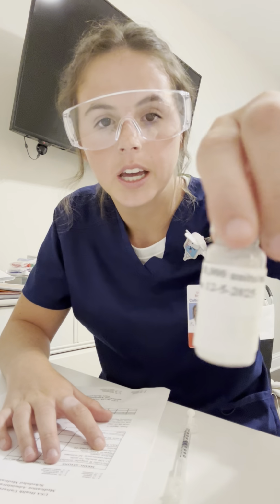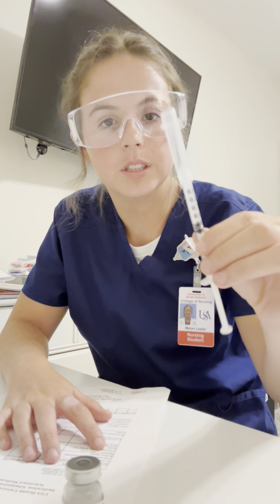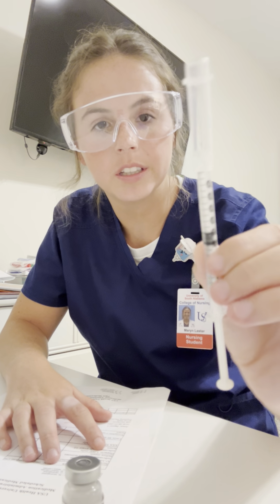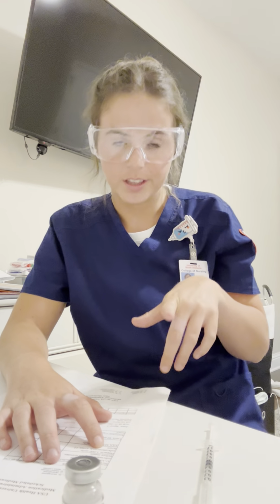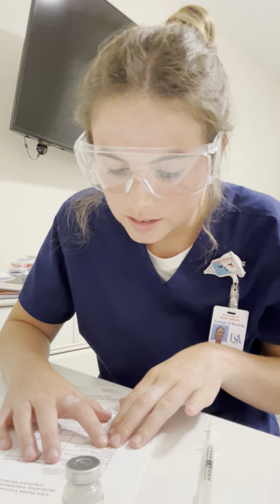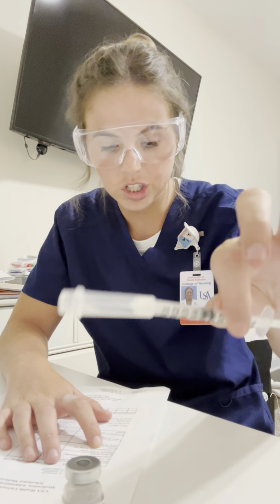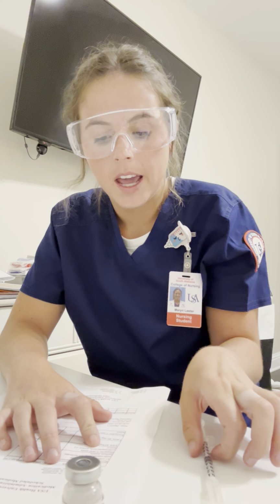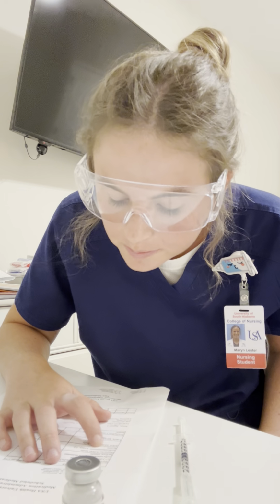We see that we drew up 0.5 in our syringe. And we'd also make sure that we verify that with another nurse. Subcutaneously, we saw that we used our TB syringe subcutaneously. And right time is every 12 hours. We're going to make sure that we do not give this before or after 12 hours. And the right route was subcutaneously.